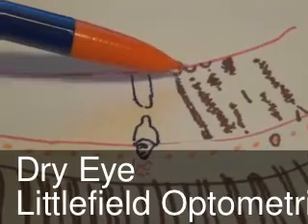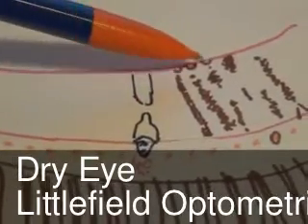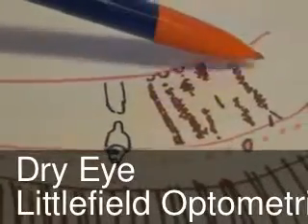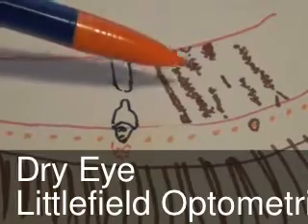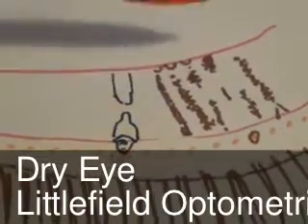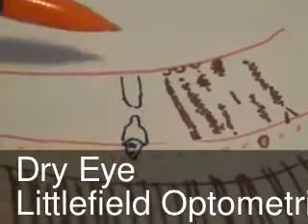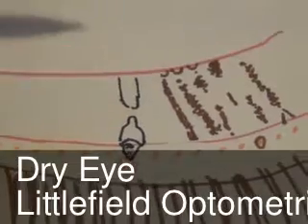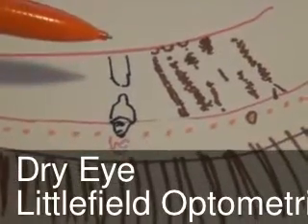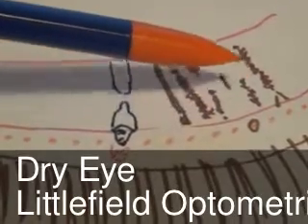Blocked glands cause convex ridging on the palpebral conjunctiva, and it's easiest seen at the eyelid fold, example here. The gland may be only blocked lower down, giving the gland a focal bulbous area. Empty glands can be seen as grey enlarged stripes. Gland stress causes irregular shape and width.